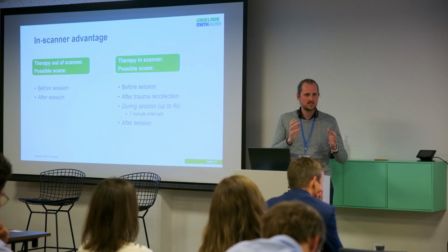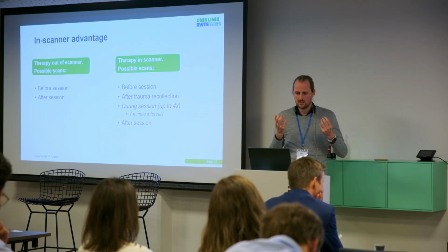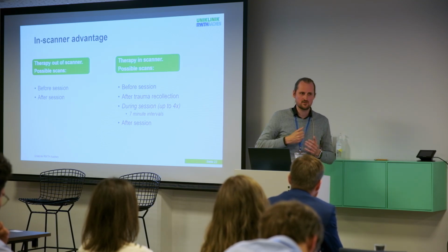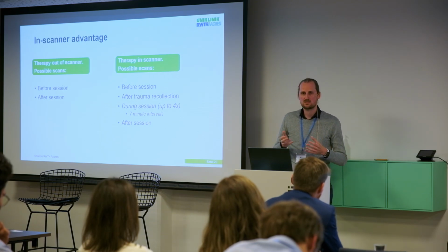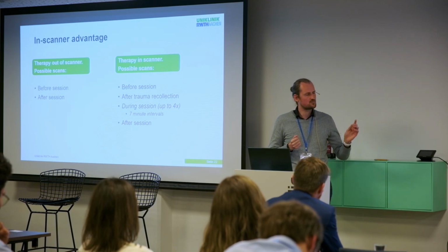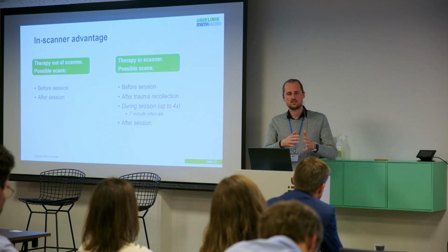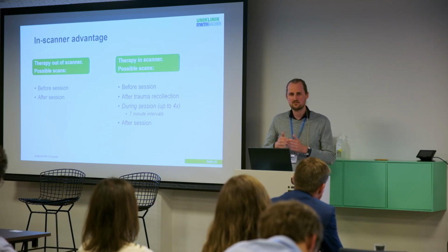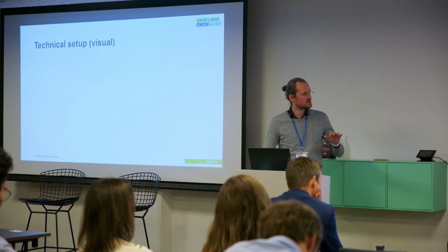Then one of the steps in these therapies, especially with EMDR, is this trauma recollection. Because the participant is located in the scanner, we can perform a measurement directly after this step. And then even during the therapy session, we can also perform several measurements. In our case, we did during the session 4 measurements in 7-minute intervals. And finally, after the therapy session is completed, we have 1 measurement, in this case also resting state, afterwards again.